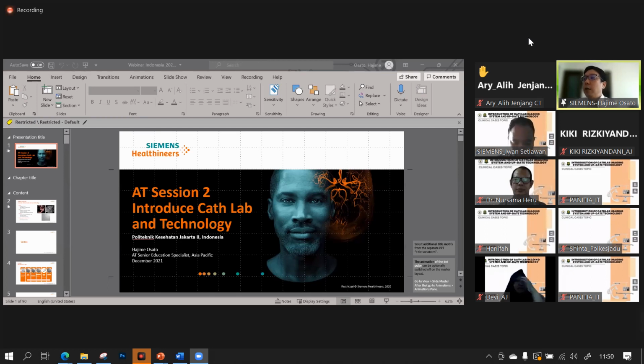For the first question, the QCA application is mainly used in Japan. Doctors always use the quantification, I mean the QCA application, for all stenosis cases. But as I mentioned, sometimes we couldn't get enough stenosis rate. It looks not like a severe stenosis, but some issue happened in the heart.